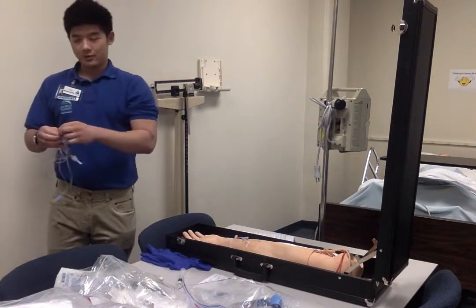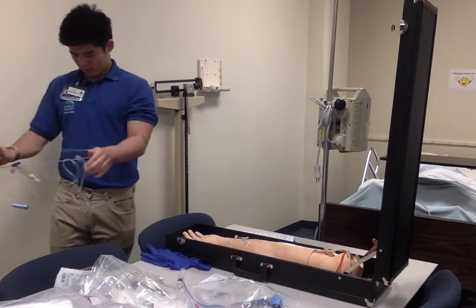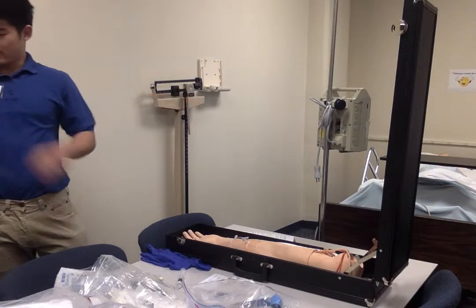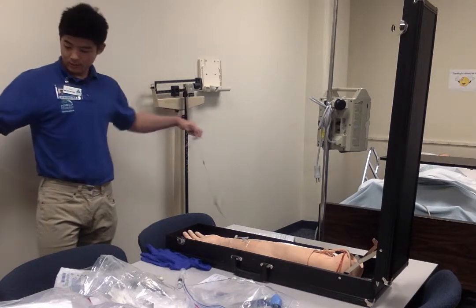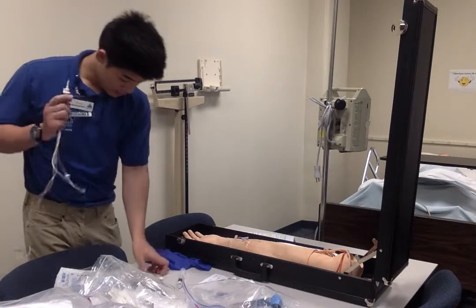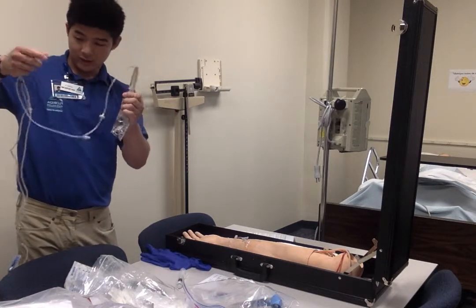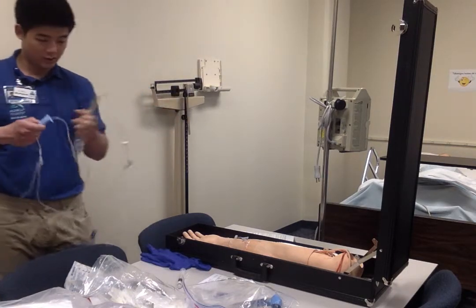Okay, here we go. Alright. So what I'm going to do, have this right here, and I'm going to poke it in. Now, first thing you want to do, once that's done, go ahead and lock so that the fluid won't come out, which is locked. That's good.